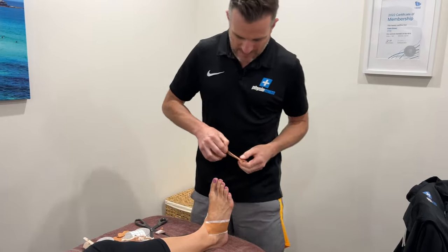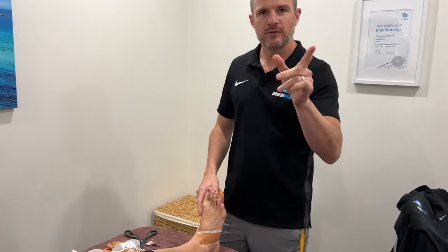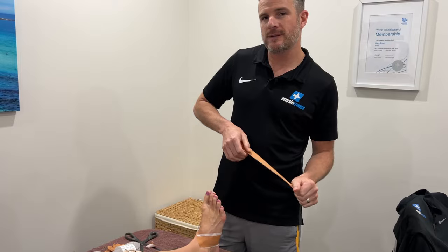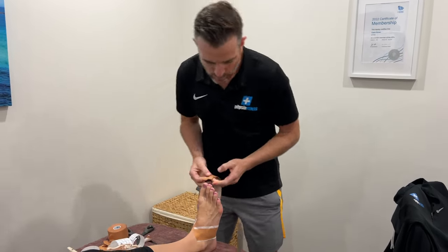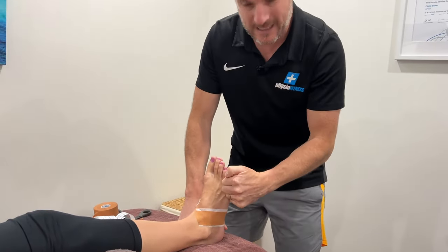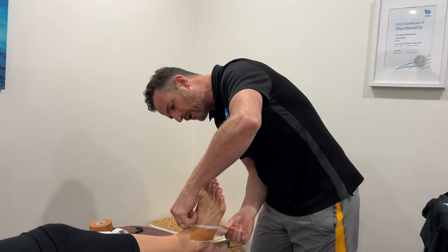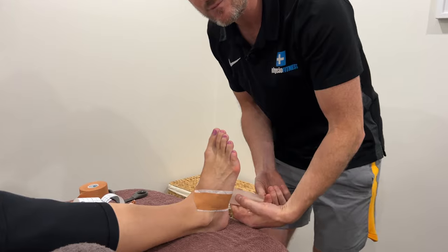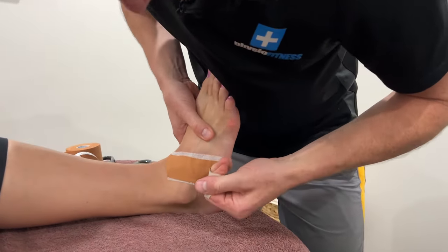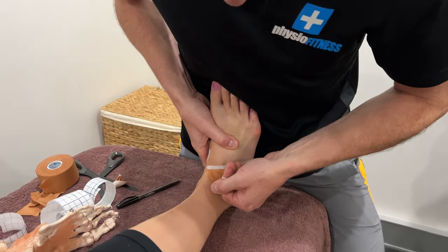So the first type of taping is going to be this - this is our trial one for her to see how it goes. What we may do is reinforce that even more. If we have to get to the point where we're putting tape in the direction of the ligament and really taping the foot up, I'll show you that. But first we want to do as minimal taping as we can because we don't want to completely lock this up - we want active movement for rehab. We just want her to be stable. I'm going to wrap that up again and come up in here, hold her into a little bit of dorsiflexion, and tighten it up.